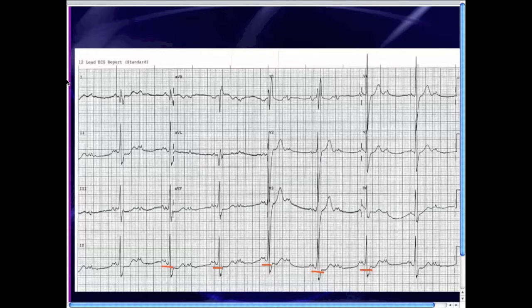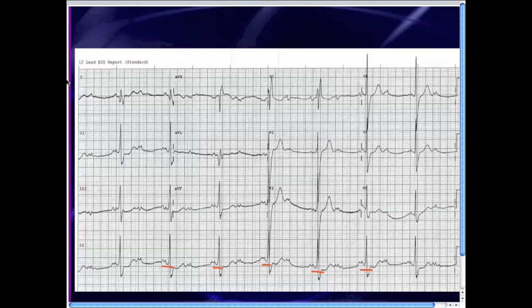The problem is that when you have second degree AV block with only two-to-one conduction — two P waves for every one QRS complex — you don't have a chance to see whether the PR segments would be increasing and then dropping, or staying the same with the dropped QRS. So the purist would say: if you have second degree AV block with two-to-one conduction, simply call it second degree AV block with two-to-one conduction. Don't bother calling it Mobitz 1 or Mobitz 2.